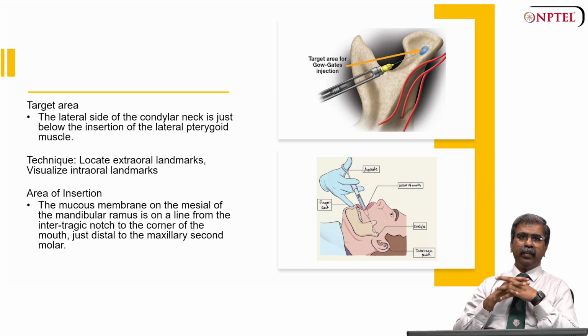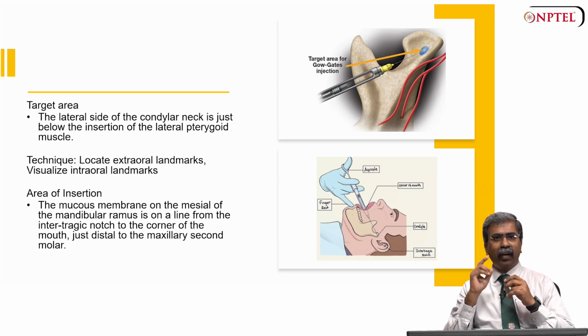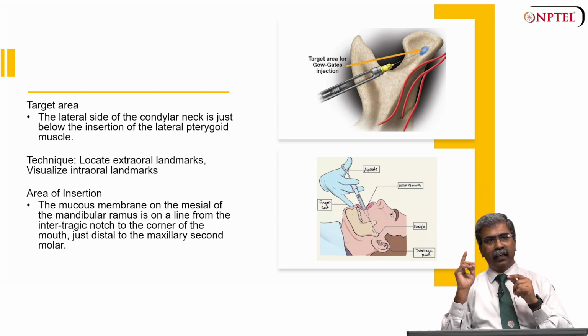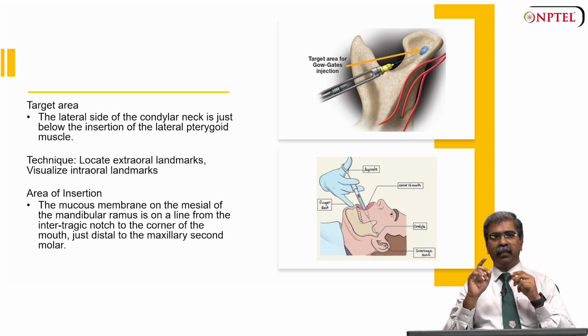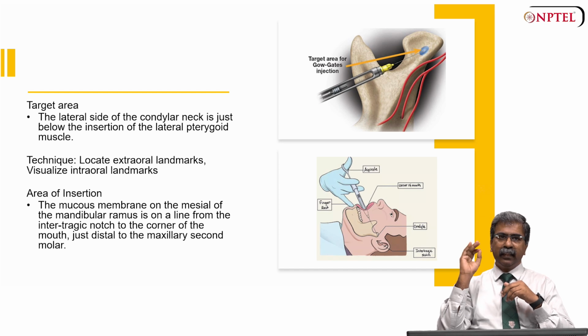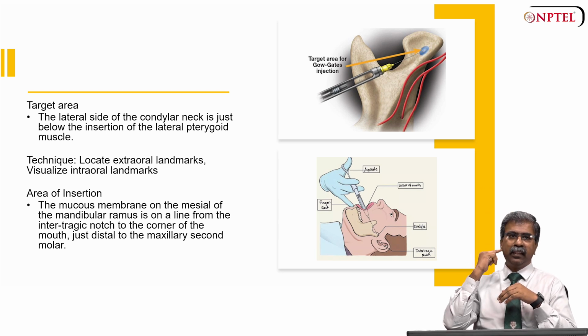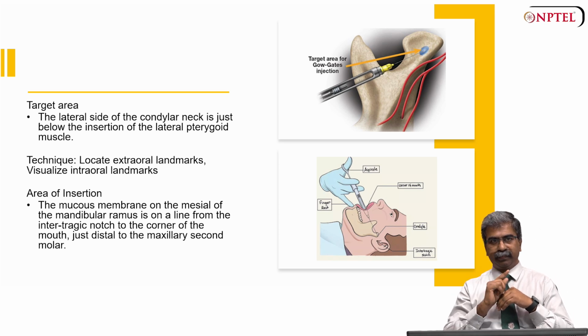What is the target area? Now coming to the technique. The target area is the lateral side of the condylar neck below the insertion of the lateral pterygoid muscle. Locate the external landmarks and visualize the intraoral landmarks, and the area of insertion will be at the mucous membrane of the mesial of the mandibular ramus from the intertragic notch to the corner of the mouth just distal to the maxillary second molar.